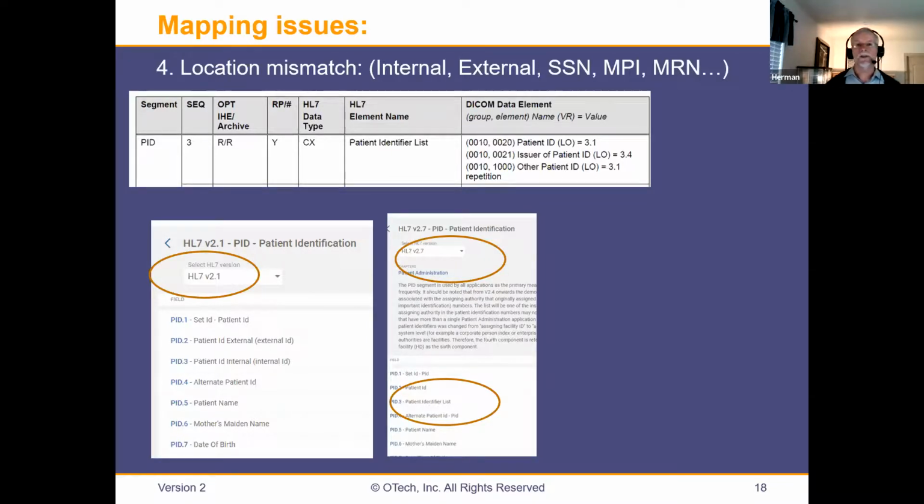I mean, we brought it upon ourselves basically, because as you can hear from my accent, I came originally from Europe. And so when I go back to where my sister and my brother still live, they have their own patient ID card. They go to the hospital and it's a patient card and they have a 1, 2, 3, 4, 5, 6, 7, 8, 9, 10 number. And nobody has any question about patient ID. But we just have to deal with, here you come to a hospital and they give you an internal ID and another hospital has another ID. So that's why we have this whole patient identification, cross-referencing and IHE, so it's kind of chaotic.